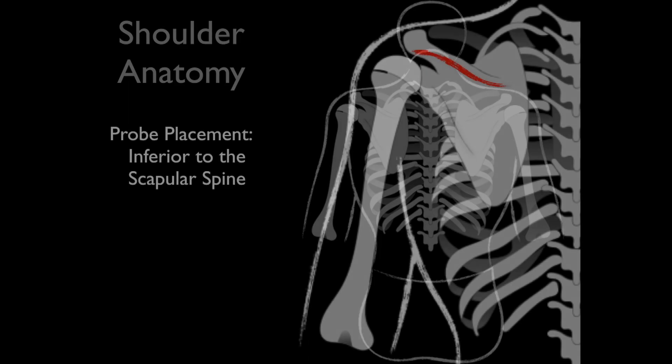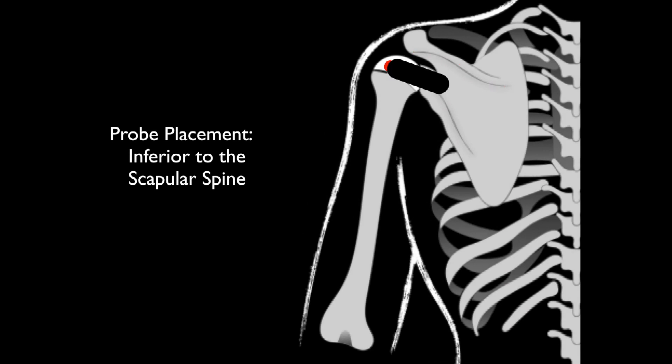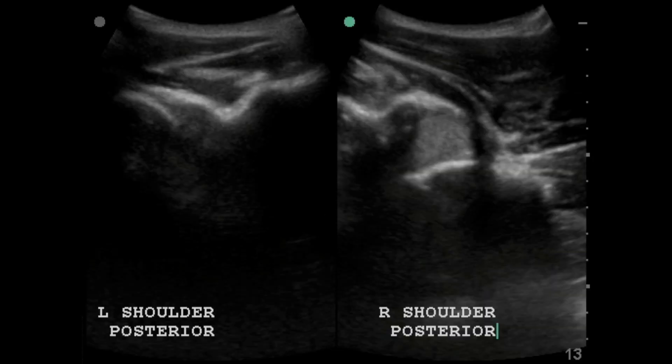Just to review, we're going to place the probe right under the scapular spine over the glenohumeral joint. We will have already diagnosed our dislocation, but just for review: what we see here is our scapular spine, and then we have our humeral head here, and we can see the hemoarthrosis — that's what we're going to go after in this case. In this patient we can see a normal left shoulder, at least a non-dislocated one, and then a dislocated right shoulder with hemoarthrosis.